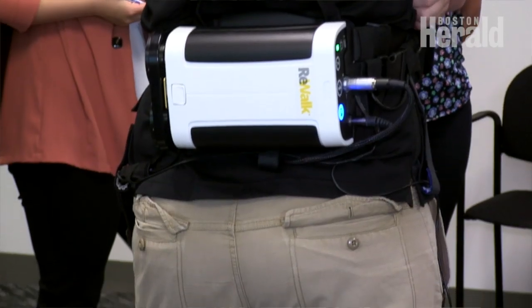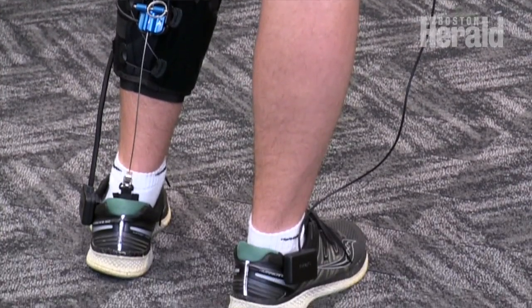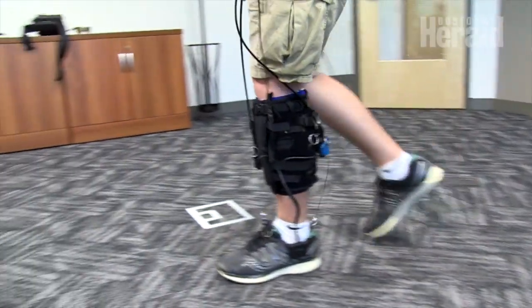We're finally at the point where we can get it to stroke patients — we received our FDA clearance a few weeks back and we're now hitting the ground running to get this out to as many people as possible. Here in the US and also over in Europe, we have clearance for sales to clinics in the range of thirty thousand dollars, a little bit less than that, and we have a few different programs where we can work with people for leasing options.